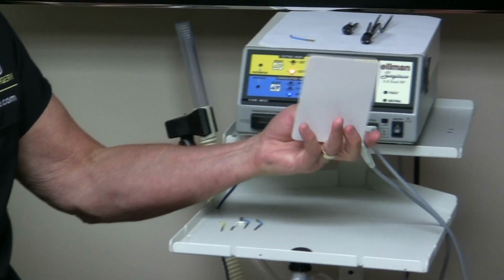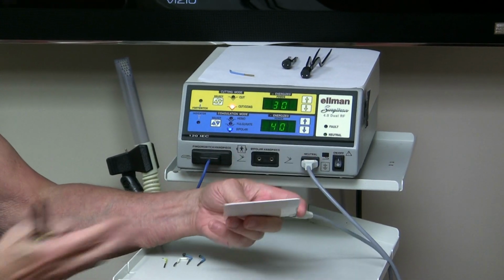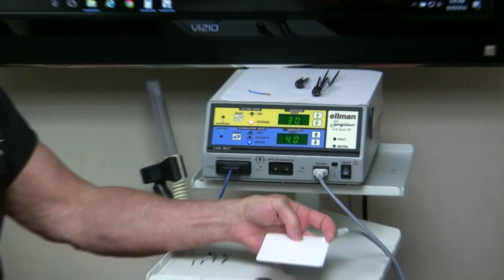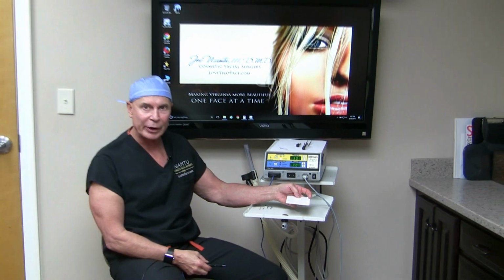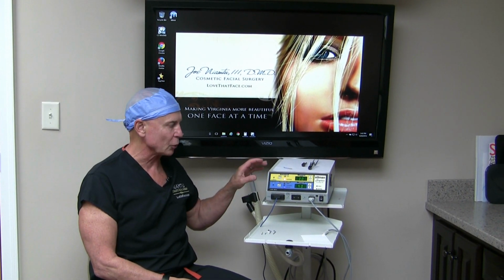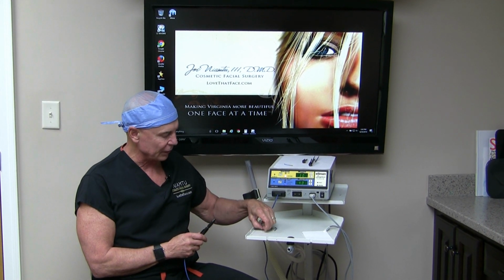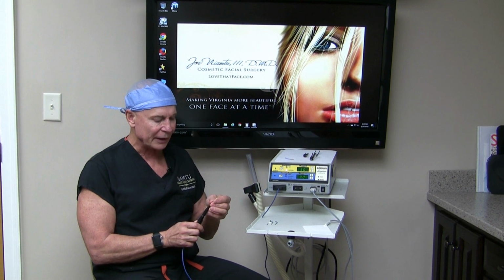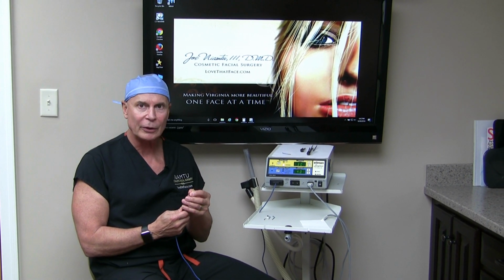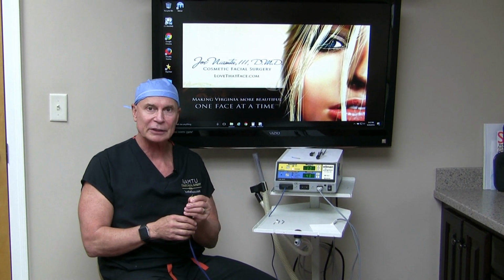And you have a neutral antenna, which is a grounding plate, but this is not like electrosurgery where you can get shocked or burn the patient. It doesn't even have to touch the skin. We keep ours under the cushion of our operating table. It plugs into a household current, generates radio waves, they come out of the active electrode, out of the tip, and they cause the fluid within the cell, the intracellular fluid, to boil, which is called intracellular volatilization, and that's what splits the tissue.